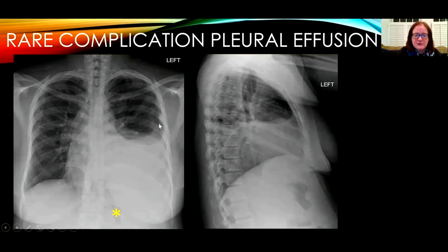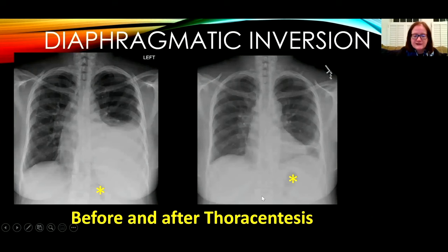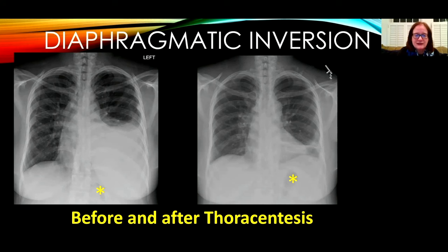This is a rare complication of a pleural effusion that is difficult to diagnose clinically. This patient has a large left pleural effusion, and the asterisk indicates the gastric air bubble displaced downwards, showing the diaphragm is depressed. After relief of the pleural effusion with thoracentesis, the stomach bubble rises to its usual location. Side-by-side radiographs before and after thoracentesis show the difference in positioning of the gastric air bubble. It's very important to diagnose this because it's associated with diaphragmatic paradoxical movement and difficult gas exchange in respiration. It's a rare finding, though.